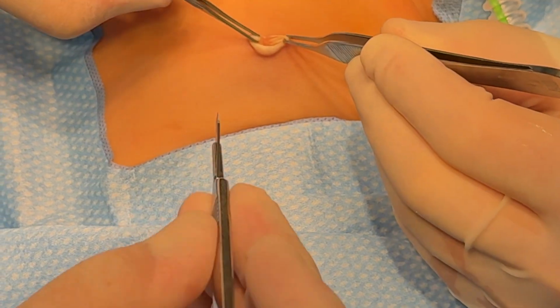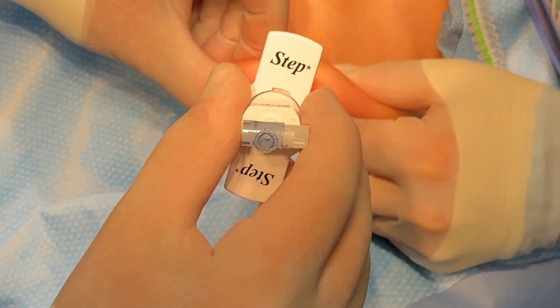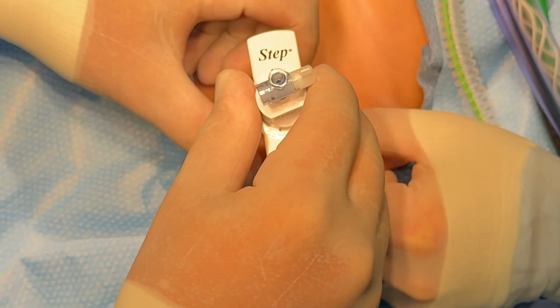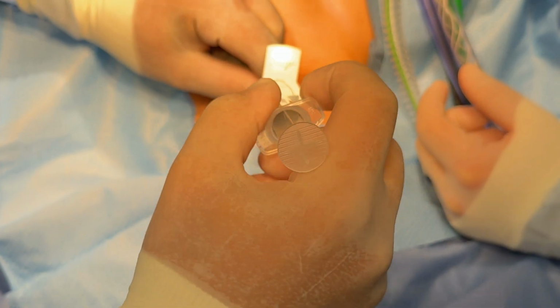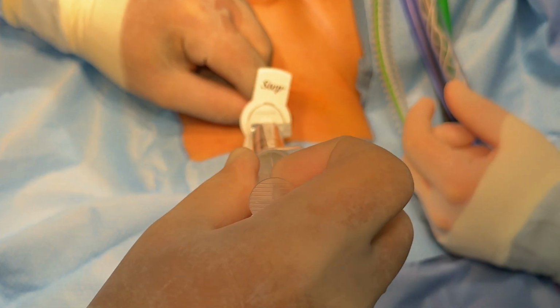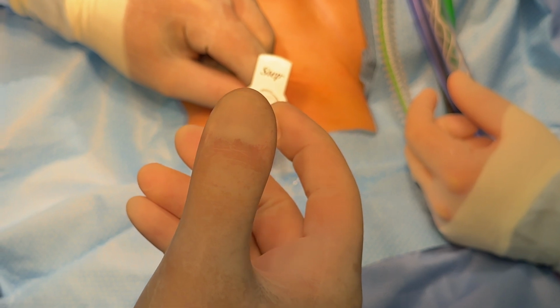An umbilical incision is sharply made using a scalpel. The Veress needle, which is aimed at the pelvis at 30 degrees, is advanced until at least 1, but possibly 2 pops are felt. The needle should feel like it is in an open cavity with no resistance. A 10 cc syringe with 5 cc of sterile saline is then attached to the Veress needle and aspirated to confirm positioning while monitoring for the return of blood or bowel contents.